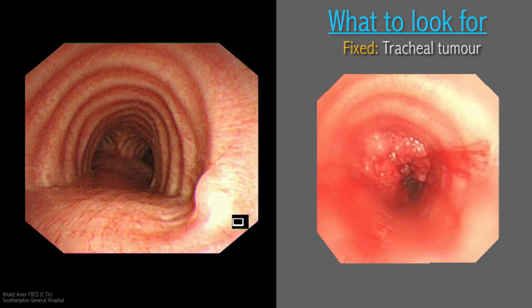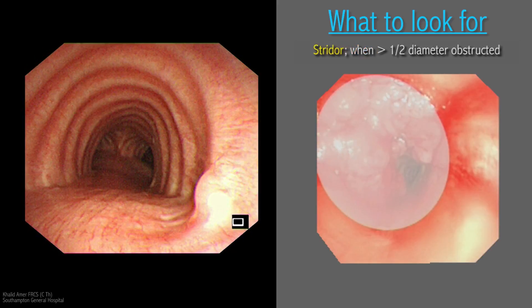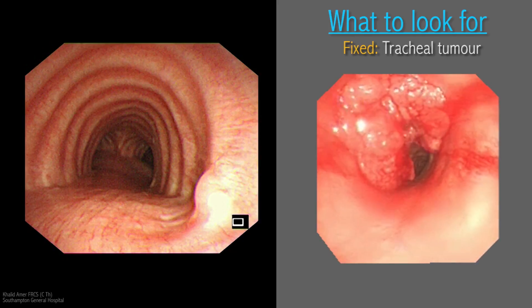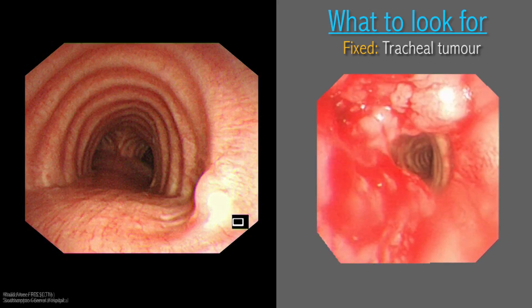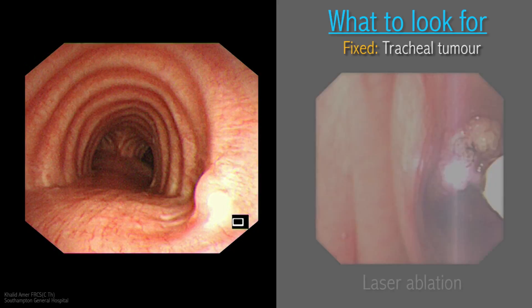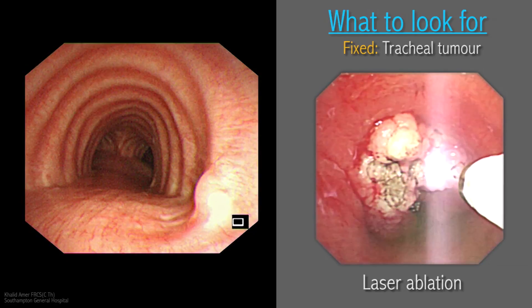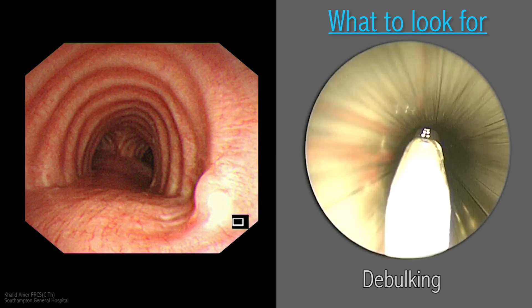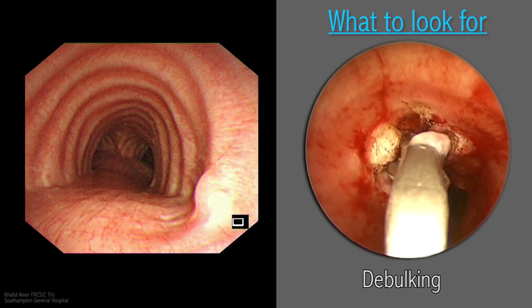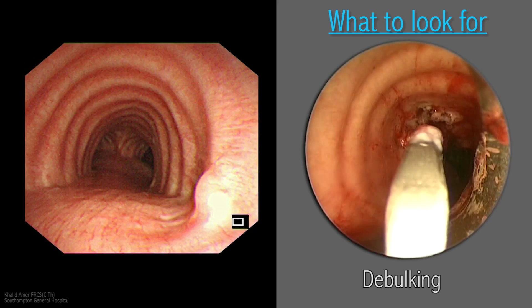Fixed obstruction could also be caused by tumours arising from the trachea, usually squamous cell or adenoid cystic tumours. Stridor occurs when more than half the diameter of the trachea is narrowed. To assess the tumour for surgical resection, note where exactly the tumour is, whether it is circumferential, how many rings or centimetres it spans longitudinally, how far it is from the cricoid cartilage, and how far it is from the carina. Inoperable tracheal tumours could be palliated by lasering or stenting, and a combination of laser destruction and debulking using optical biopsy forceps can sometimes unblock the airways, opening the possibility of stenting.